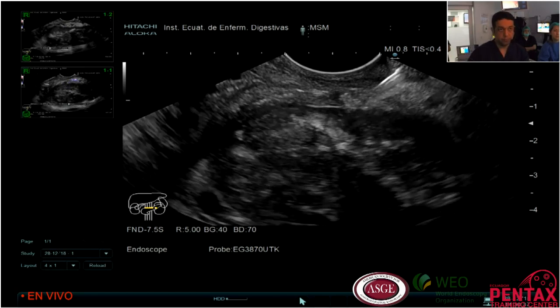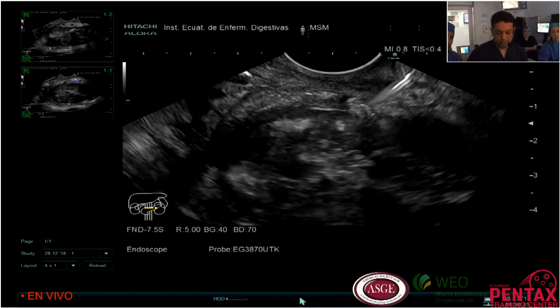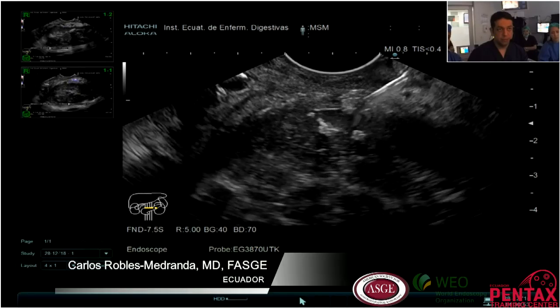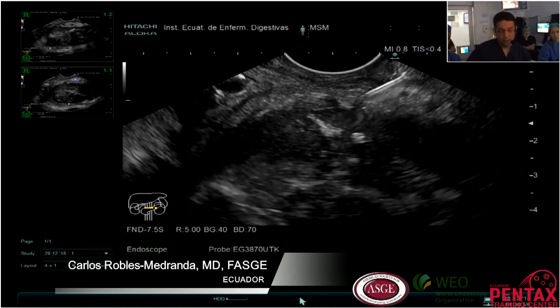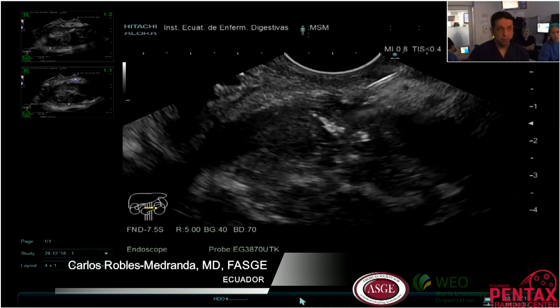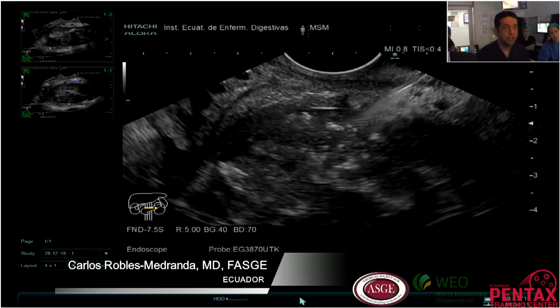Empuja, Clever. Sigue. So you see, my guide wire is moving inside the necrosis. Empuja. So I am going out, un momento, with my needle, and now my technician will help me. Empuja, sigue empujando. Pushing my guide wire inside, as you can see here.